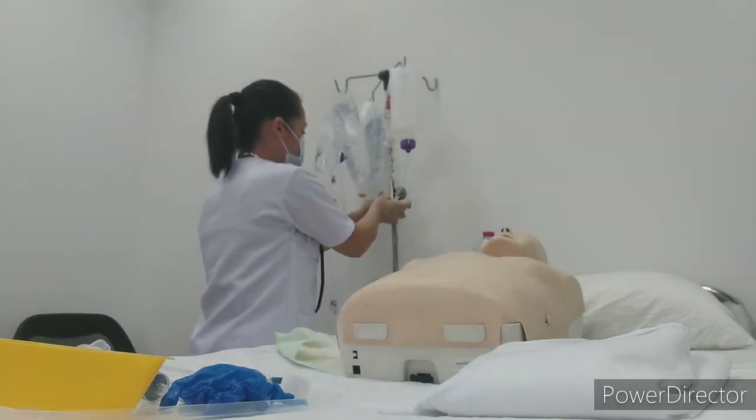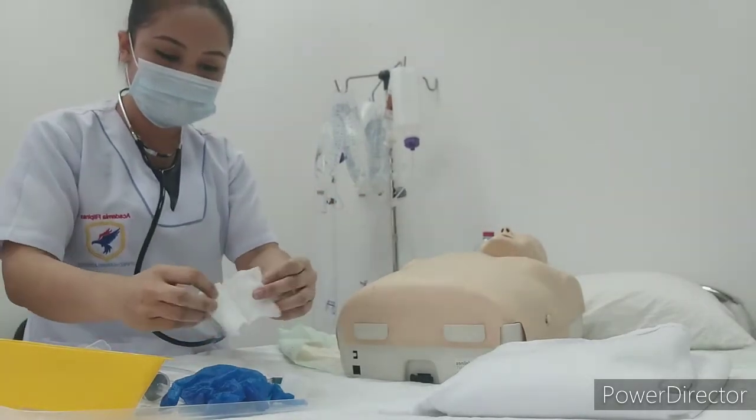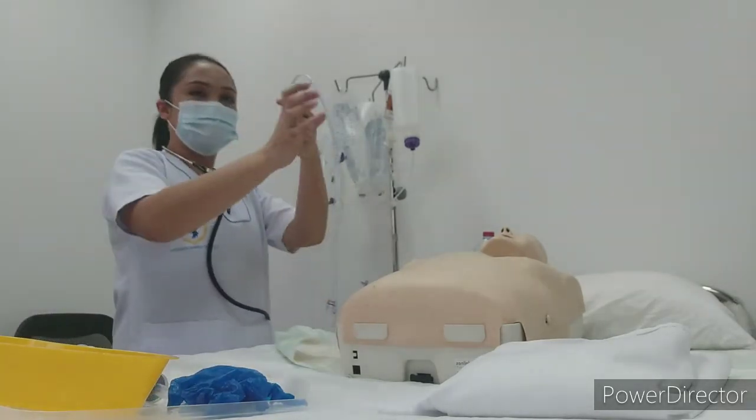Here. Okay. So take the gauze. There's another one. Okay. Put lubricant gel. Set aside. And now we will take the NGT.